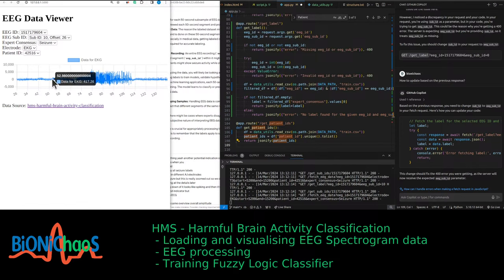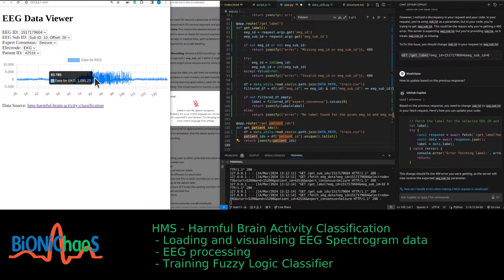It's just highly unusual. The ECG seems to be still there, but this artifact should be coming from the brain and not the heart, if it is a seizure. So in this case, it is most likely to be muscle activity. I guess there's a chance that there's a cardiological event affecting the brain recordings. But yes, you don't expect to see ECG in your EEG. That's really not a good sign. Most likely just a bad data point.